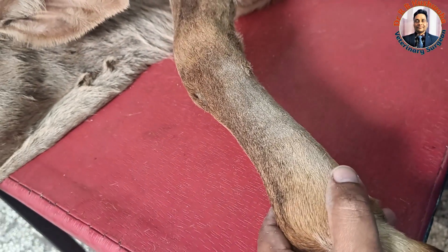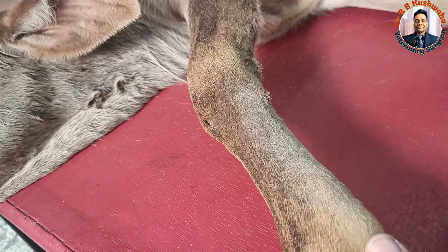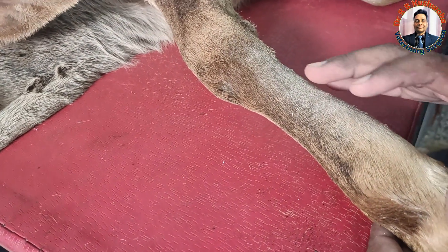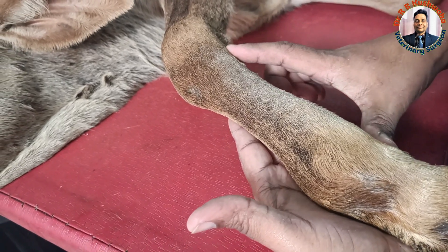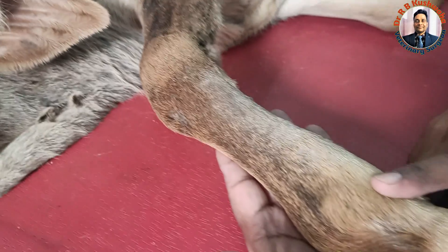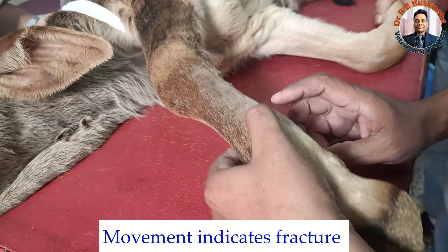For external coaptation, whether using plaster of Paris bandage or synthetic cast, the principle is that we should immobilize one distal joint and one upper joint at the fracture site. Whatever splint we apply must extend from here to here to immobilize the carpal joint as well as the fetlock joint. Some doctors apply the splint only up to a lower level, which is not correct because in that case there is no immobilization of those joints. Always include one joint above and one joint below the fracture site.